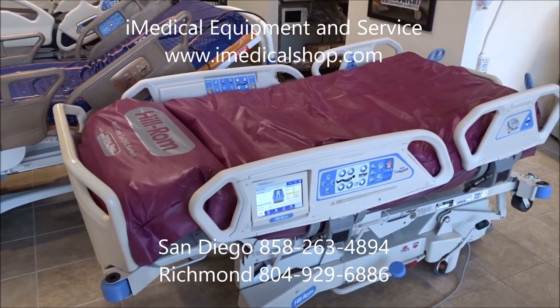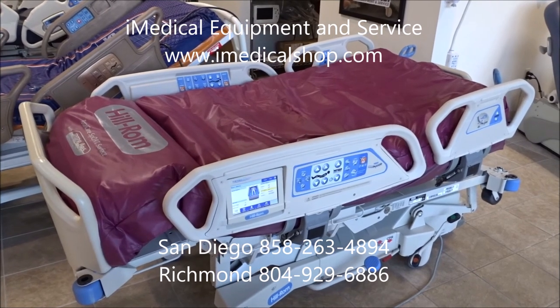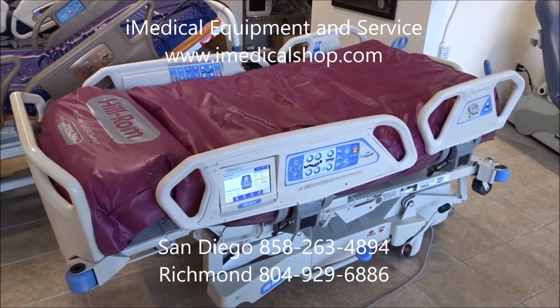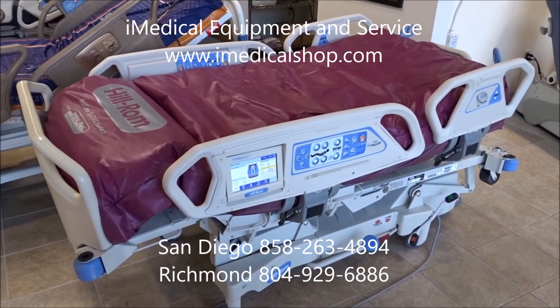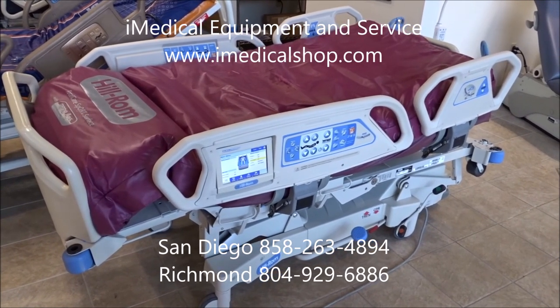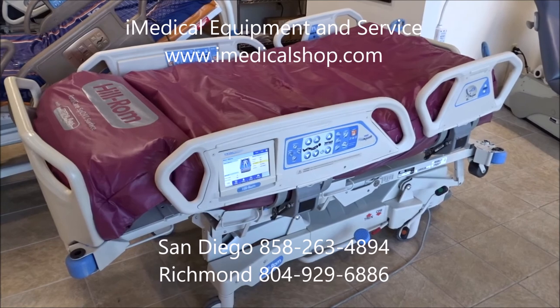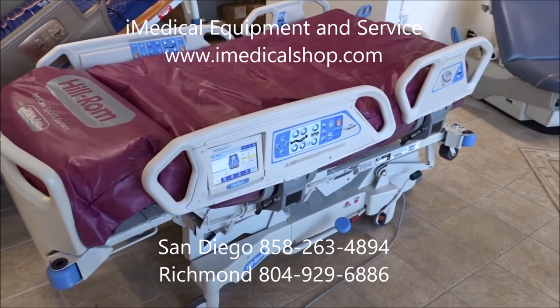We're at iMedical Equipment and Service doing an overview on the Heelrom P1900 Total Care Sport 2. This is a setup and basic instructional video on the bed itself, for people that have the bed and want an overview of its features. We did a similar video on the Sport 1 about four years ago, so this will be a good overview for anyone with the Sport 2.